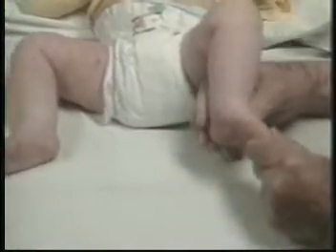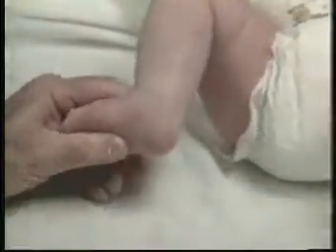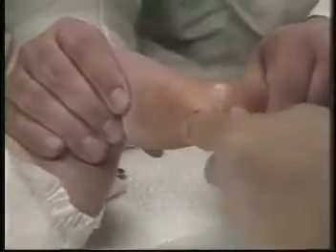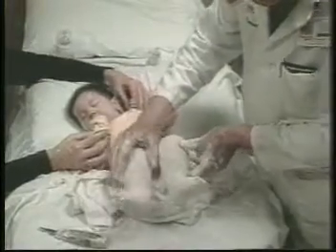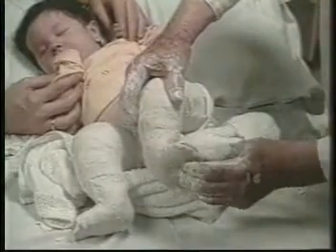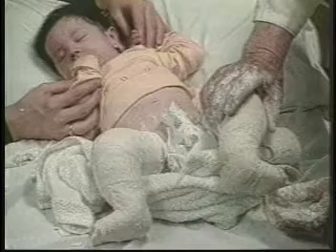Five days later, after the fifth casts are removed, the feet are corrected except for the equinus. The tendo Achillis is tight. After applying a betadine prep and under local skin anesthesia, the tendo Achillis is percutaneously severed in both feet. The last plaster casts are applied holding the feet in 70 degrees of abduction and 15 degrees of ankle dorsiflexion. The arches of the feet are well molded. The baby was not bothered by this minor surgery. After the tenotomy, and with the last casts on, the baby and mother returned home to Idaho.